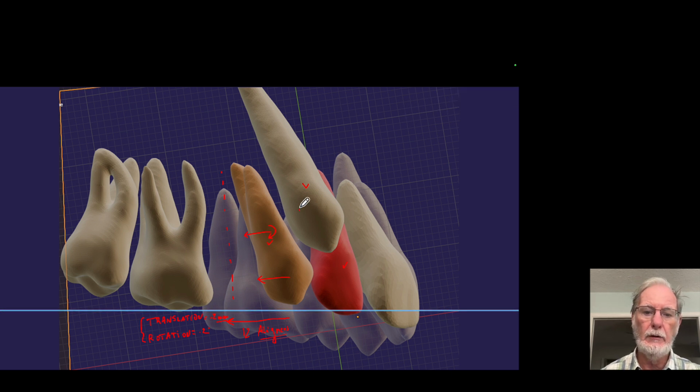But the more discrepancy you get, or the larger the moments that you need to apply due to torque characteristics of the position of the tooth at the initial movement, then the torque, as we have with a force driven, may not be effective and may end up requiring more aligners.